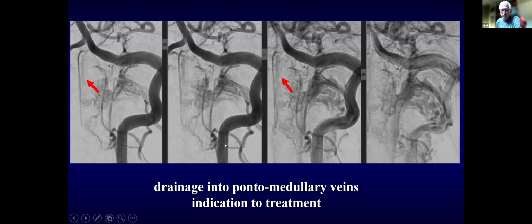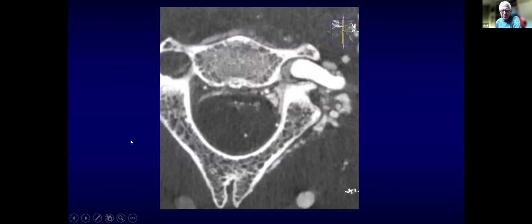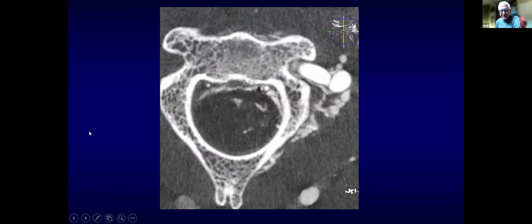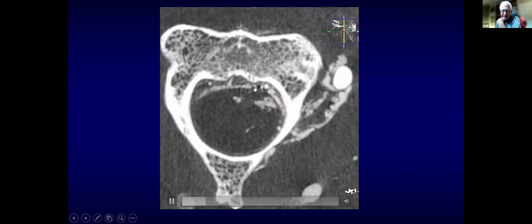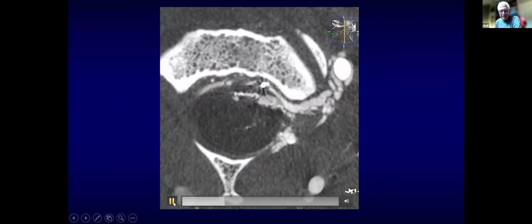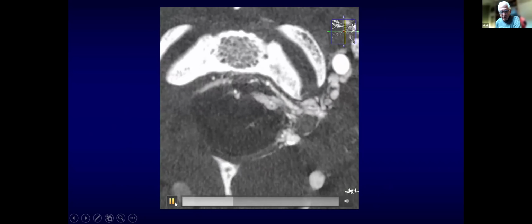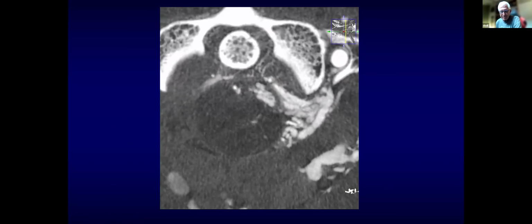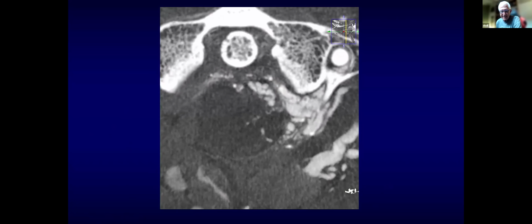And the treatment considered was to get here in the venous pouch through a venous approach. And Pietro went there with a microcatheter, but this is the most interesting image. You can see a little tiny bubble of air in the epidural space. But then I will go back a little bit here. I just let you see all this.